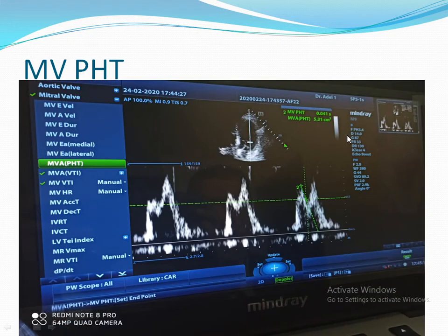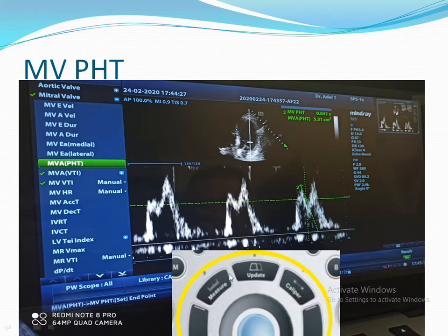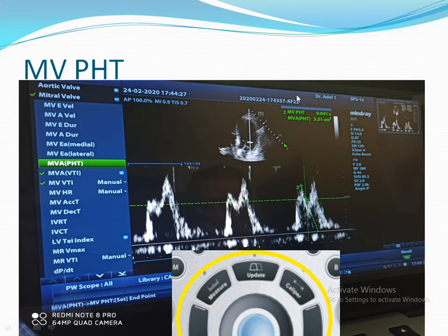If you want to measure Mitral Valve pressure halftime, you have to choose Measure, then choose Mitral Valve pressure halftime. It will start from the peak of the wave. You follow the slope of the wave and you will get the Mitral Valve pressure halftime.